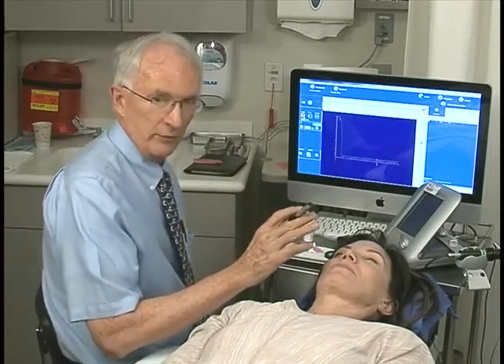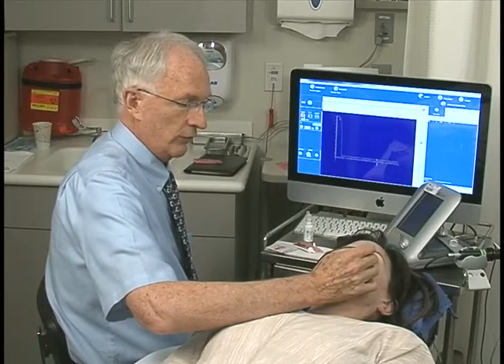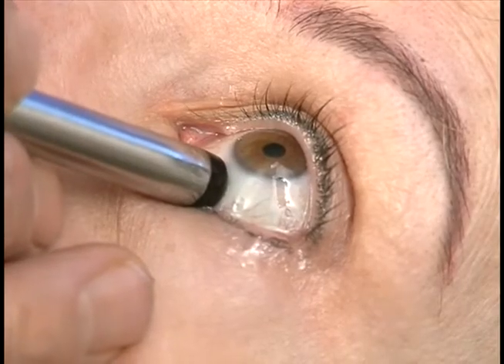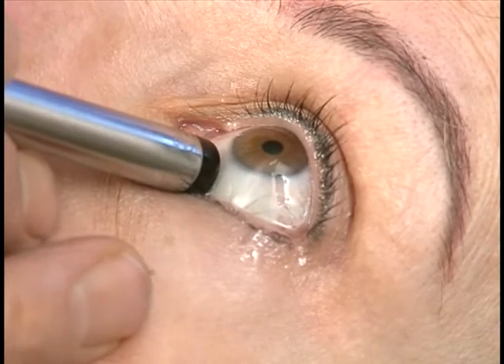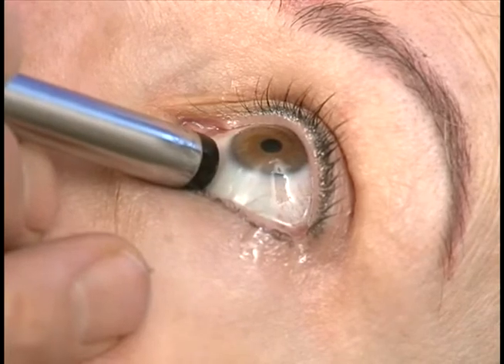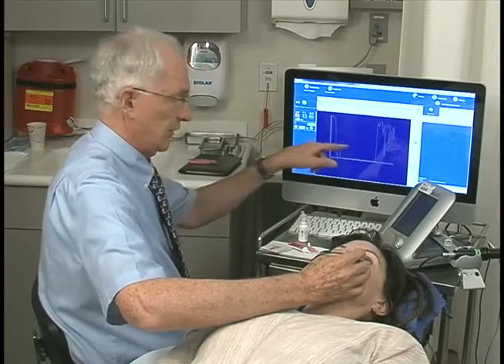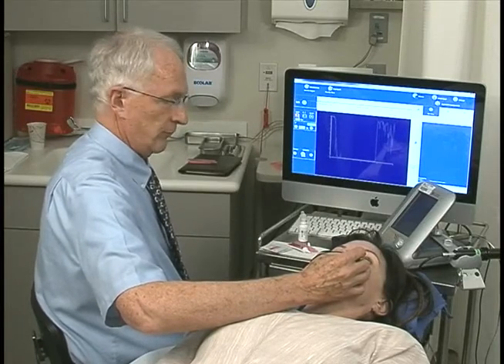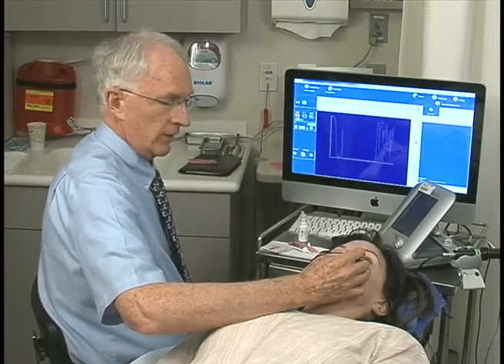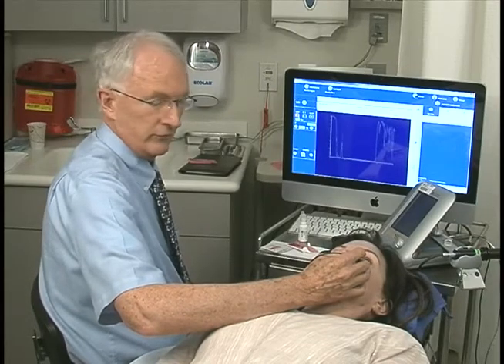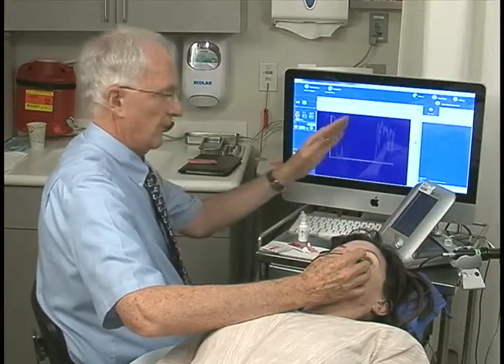The patient has had a drop of anesthetic placed in the eye, and I have the eye open. I will demonstrate on the left eye placing the probe at the 6 o'clock limbus, and then I aim superiorly going across the eye to display the superior part of the globe. So even though the probe is at 6 o'clock, I'm displaying the 12 o'clock position in the globe. As I move the probe, I angle it down towards the inferior fornix and I watch the display on the screen. The initial spike is from the probe itself. I'm going through the vitreous here, which is usually a flat line because there's no reflection within the vitreous cavity, unless there's vitreous pathology. And then I see the fundus spike, which is a high-rising spike in the back of the eye.